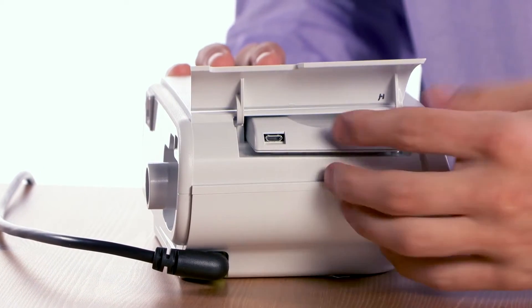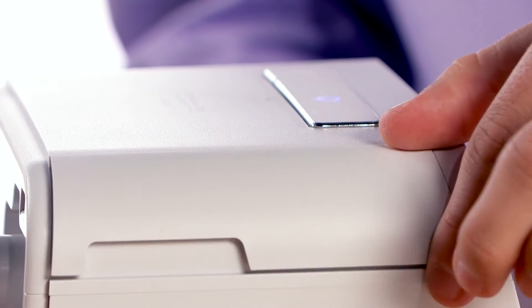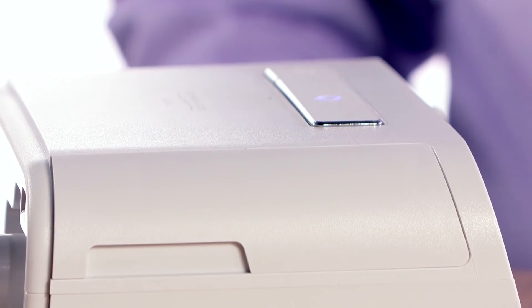Gently press the modem until it clicks into place. Now close the accessory door. Note that your modem may appear slightly different.